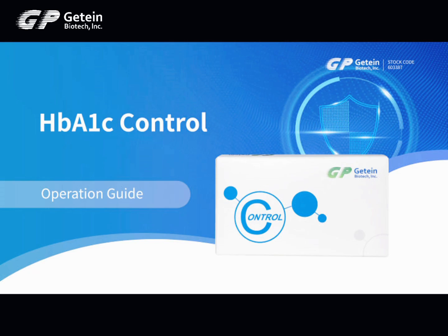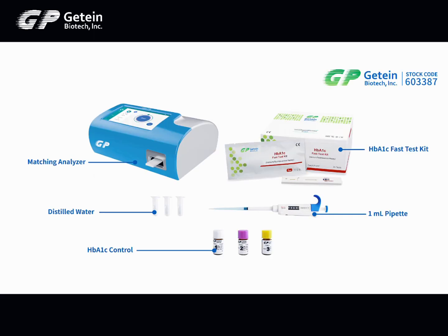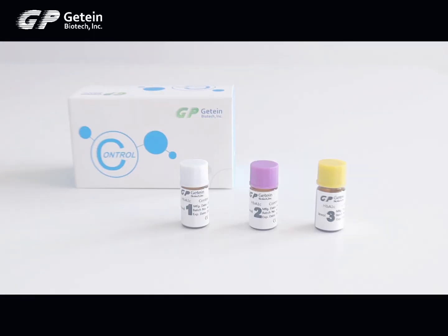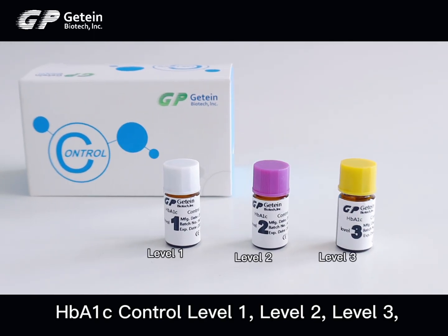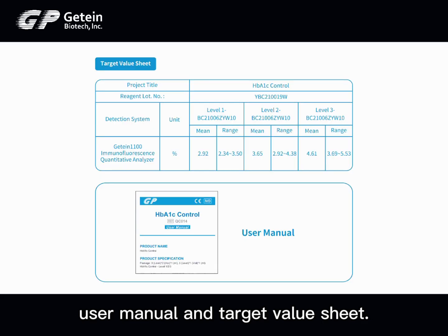HB-A1C Control Operation Guide. The kit contains HB-A1C Control Level 1, Level 2, Level 3, a user manual, and a target value sheet.